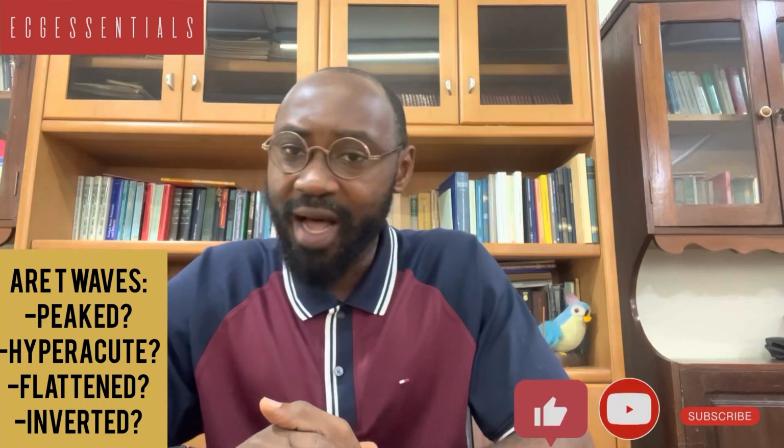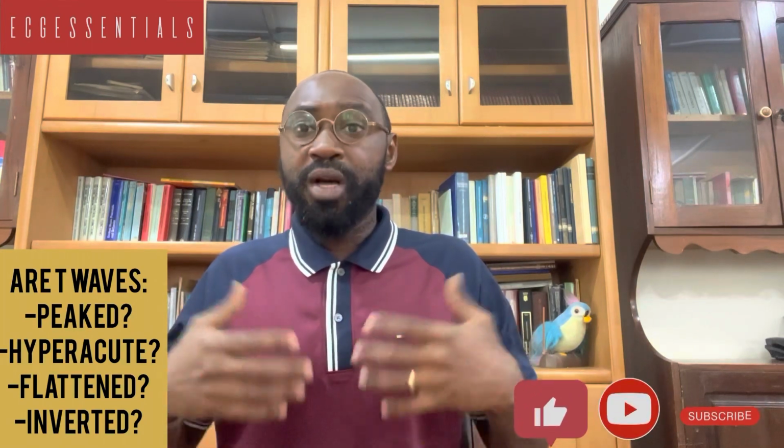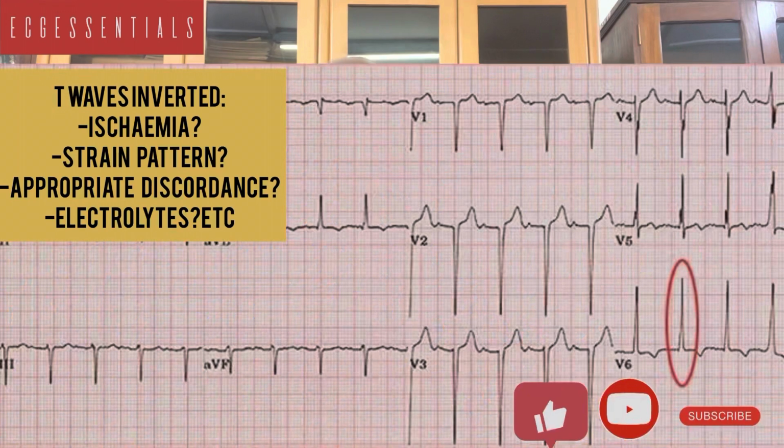T wave inversions are the other thing that we need to look at. And T wave inversions usually may point to myocardial infarction or ischemia. That is, of course, having taken the clinical context into consideration. But if we are not talking about ischemia or infarction, the other possibility is a strain pattern, say a left or right ventricular hypertrophy, in particular leads.